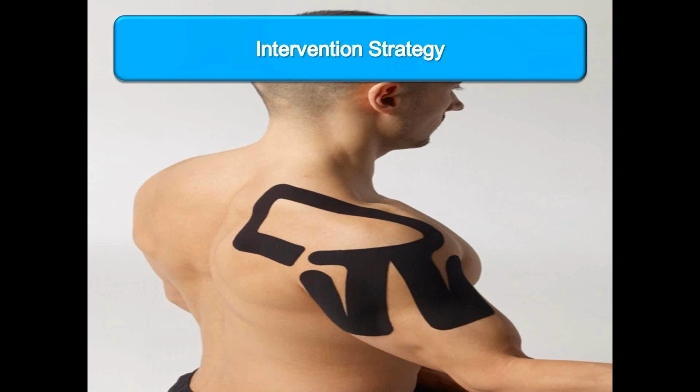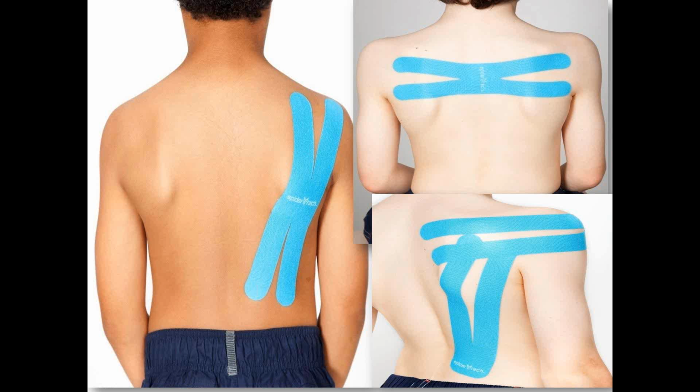We could also see how we could use pre-cut strips. So here are some X and Y strips that SpiderTech has in a pre-cut format that you simply take out of the box and apply. These were principally designed for pediatric cases, but you can also use them on very small adults, or you can use different combinations to try to achieve some of the full pre-cut applications.